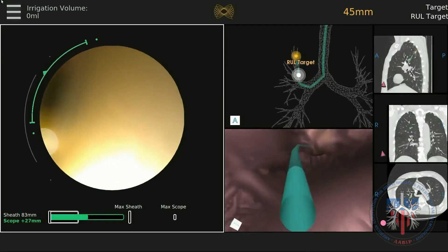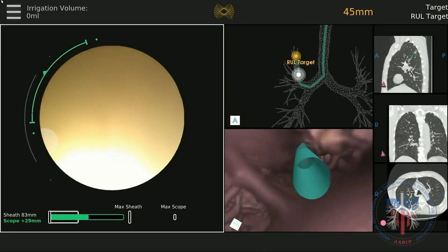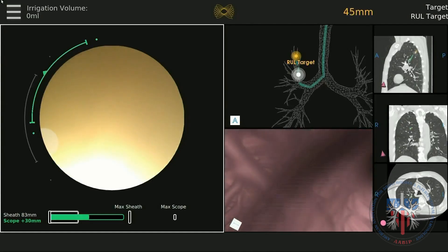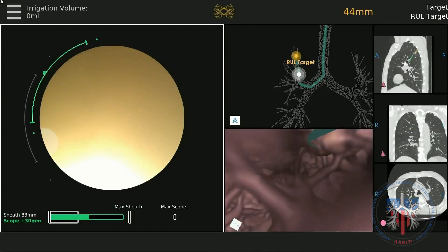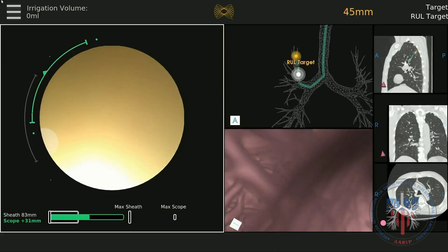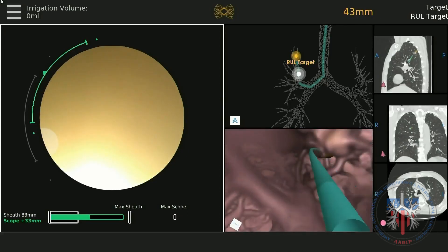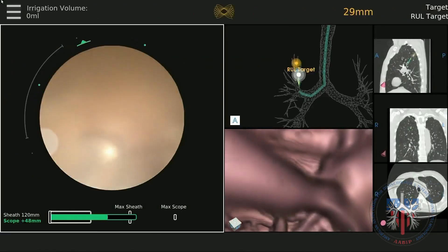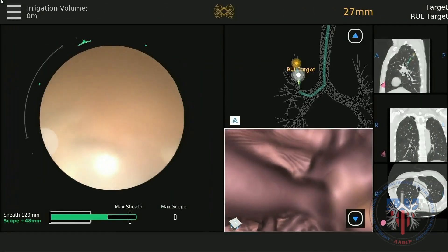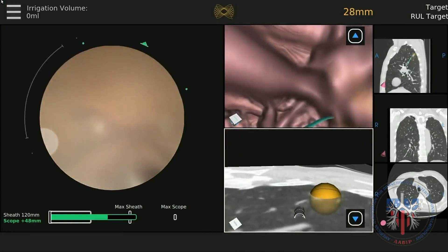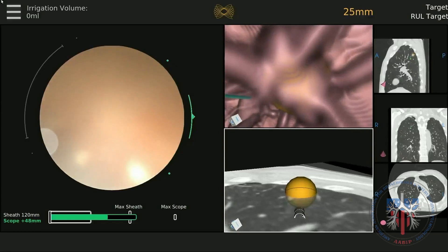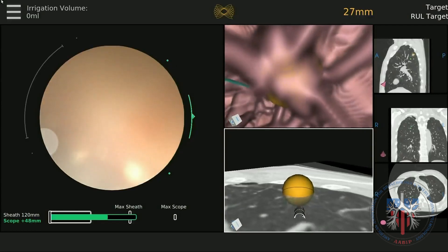Sometimes airways may be noted which are clogged with mucus or debris. Flushing with saline or air can sometimes be used to clear the debris. Keep in mind that flushing or suction may change the view. After aligning the target, the radial EBUS can be inserted to evaluate accuracy of the position. Once satisfied, hit the round button — the play or pause button — and the navigation portion is now complete.